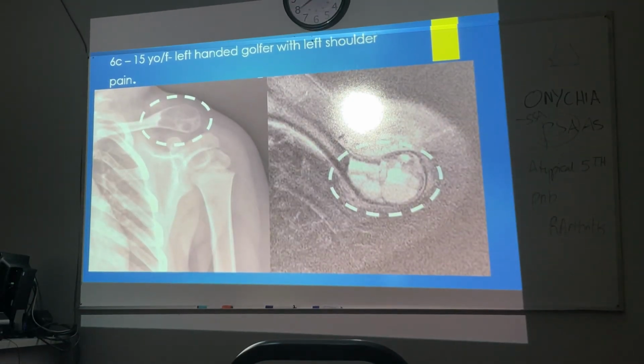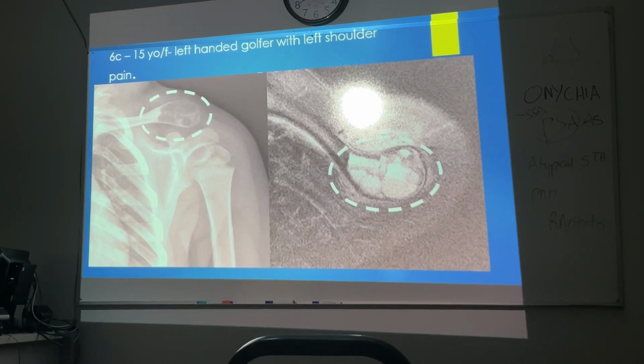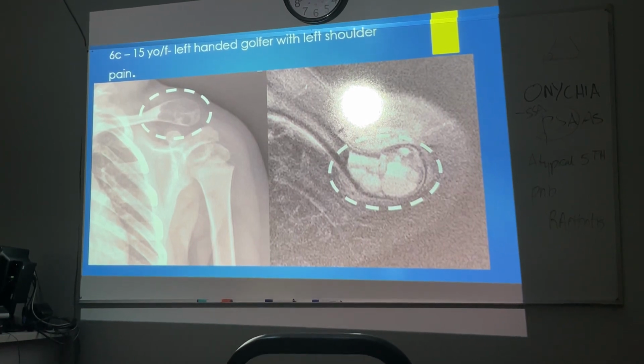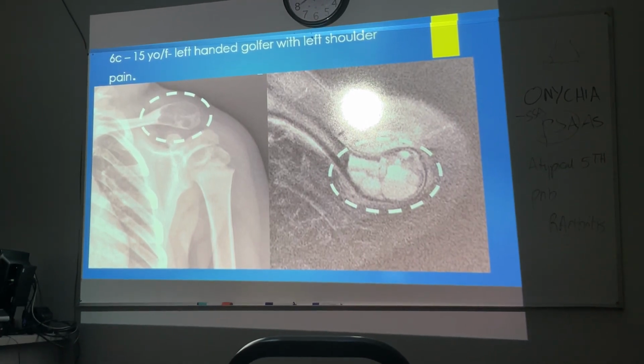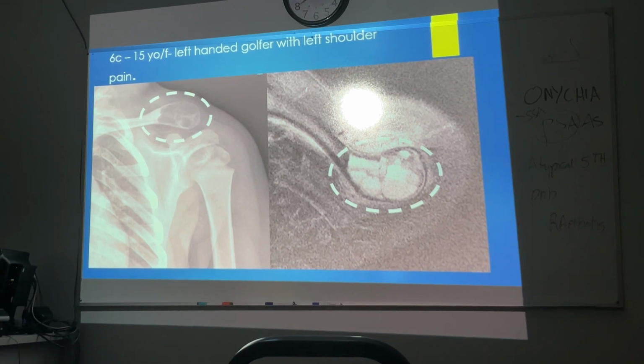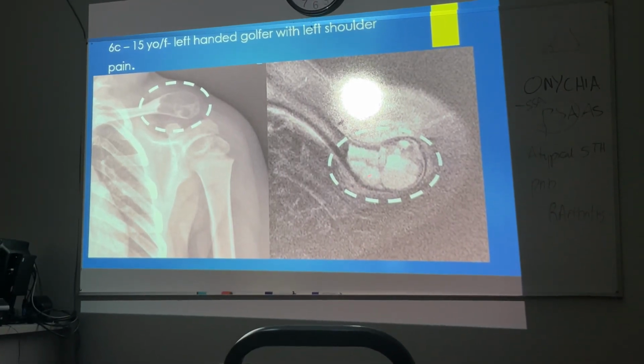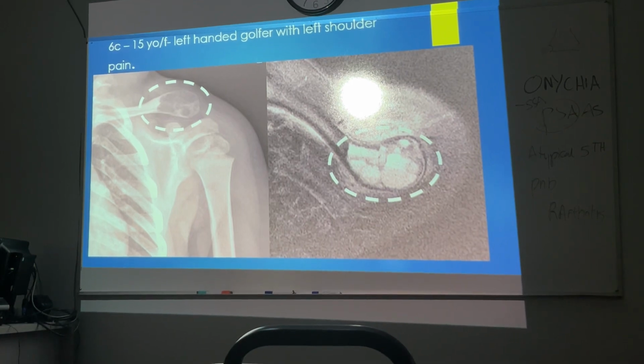Okay. Now, this is still fluid levels. Fluid levels in the cyst world means what? ABC, okay? This is unusual in this area of the clavicle. So for board preparations, I'll make sure ABC, number 1 spot is around the knee somewhere, distal femur, okay? So you want to know at least the most common site. This is not a common site for aneurysmal bone cyst, but the fluid levels clinch it for being ABC.